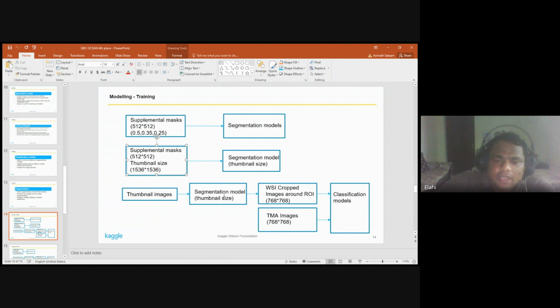And for the training methodology, during training I know the class of the cancerous tile, so I select only the tile having the high probability of having that particular cancer. During inference, I would not have that data.